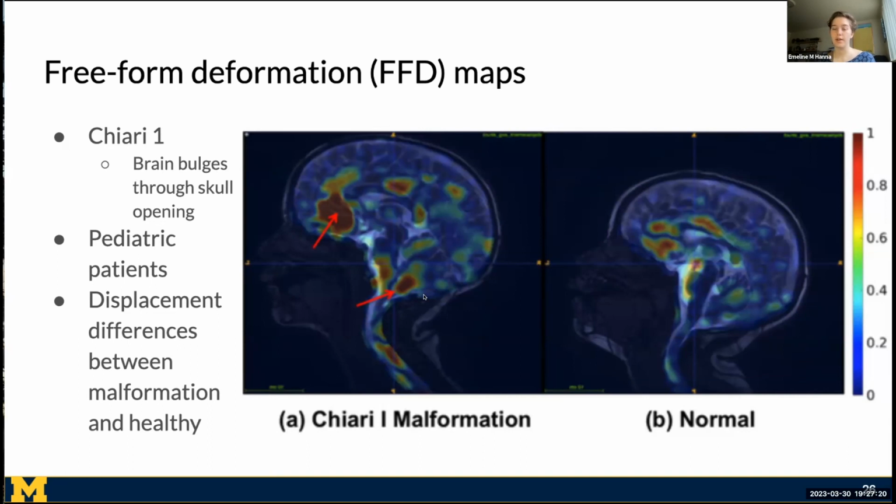And one thing that wasn't talked about in the paper, but I found interesting, was that when I was researching the Chiari-1 malformation, there were a few places who said that the signs and symptoms may not occur until late childhood or adulthood. I don't know the specifics about this pediatric patient's case, but as a 3-year-old, I just wonder if this allowed for an earlier detection than would have otherwise happened. That's maybe an exciting possibility, because I think this is something that can be treated by removing some material.